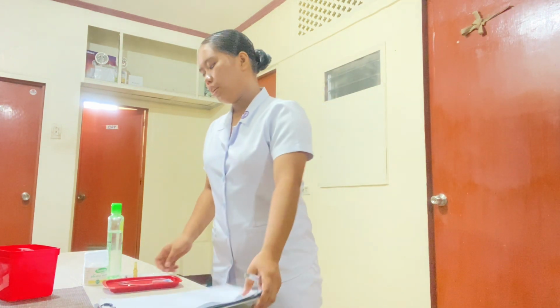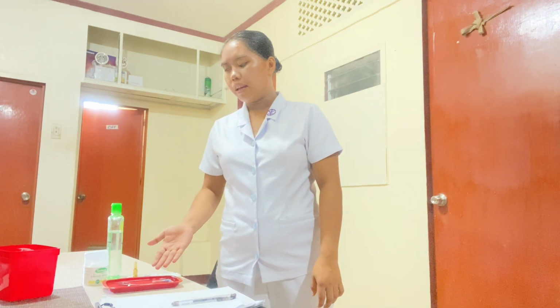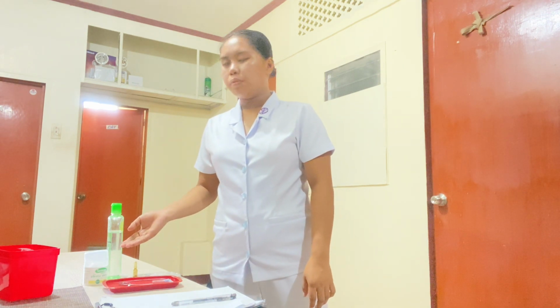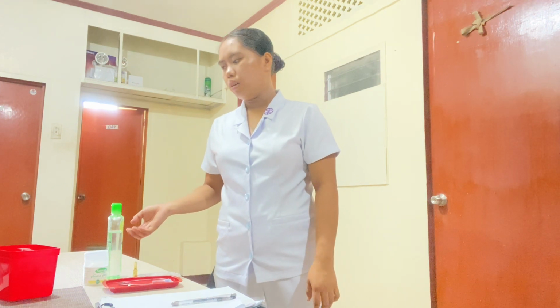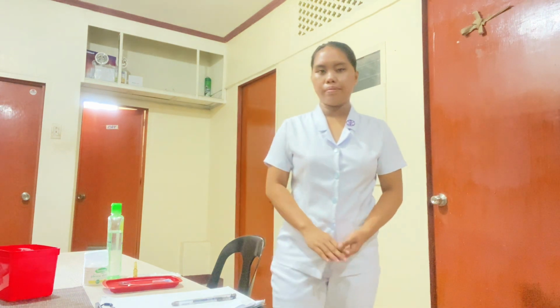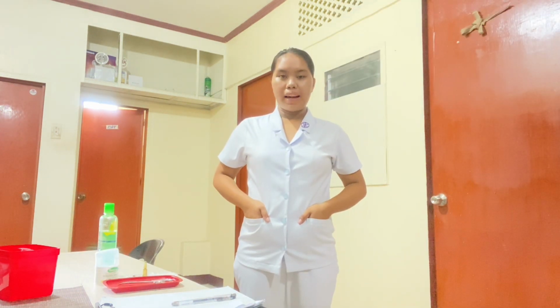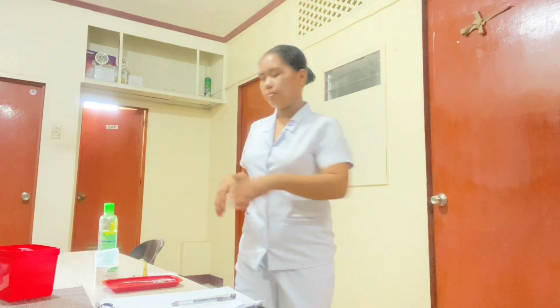So now I have here a 5cc syringe, aspirating needle, forceps, medication tray, ampule, 70% alcohol solution, cotton ball, and also a sharps container. Perform hand hygiene to deter the spread of microorganisms and observe other infection prevention procedures.